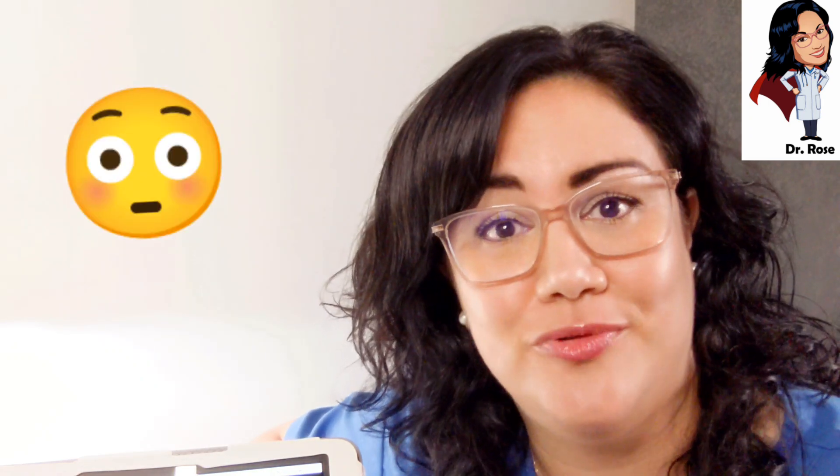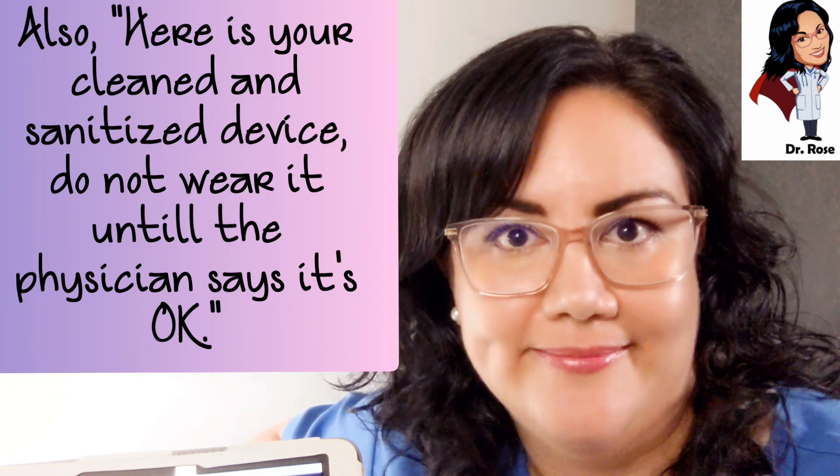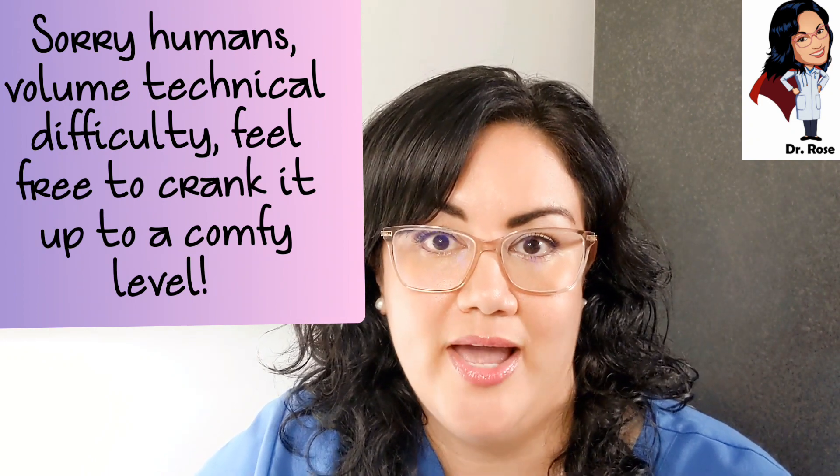For audiology students learning otoscopy — when you see something like this for the first time, you almost need to excuse yourself and have an out-of-body experience, because the last thing you want to do is scare the patient. Rehearse what you'd say: 'It appears that you have some debris in your ear that could be an infection, so we need to get you to the ear doctor right away' — then end with a calm smile. Also, if you find evidence of potential infection, tell patients to discontinue hearing aid use and clean the aids as much as possible.